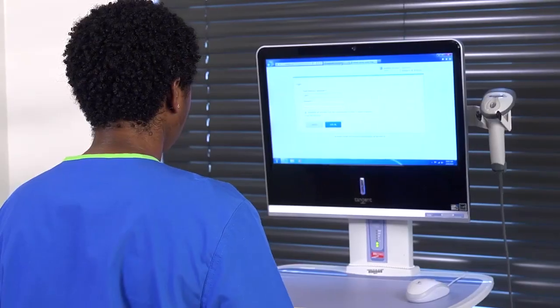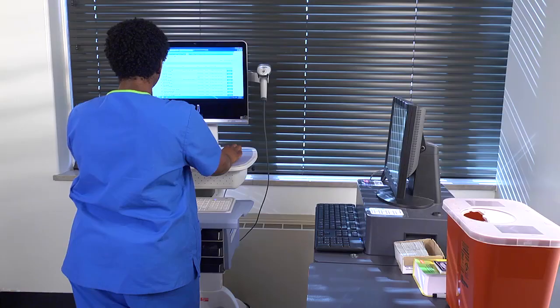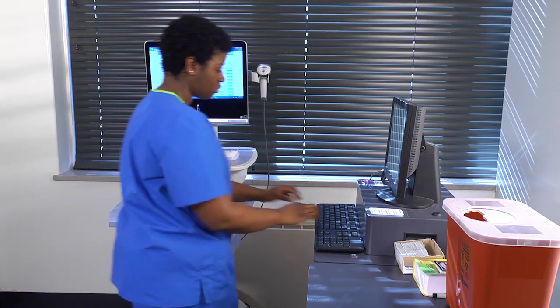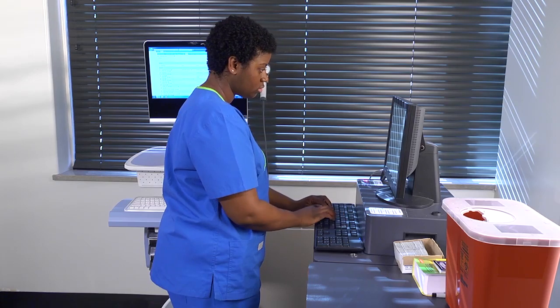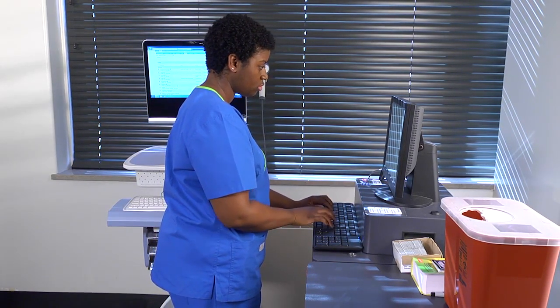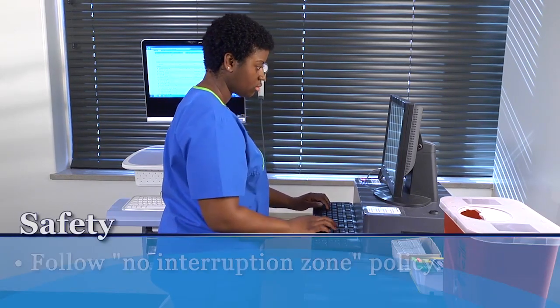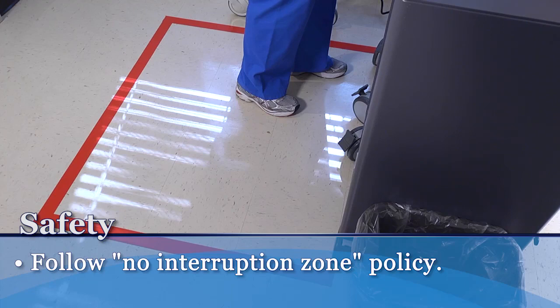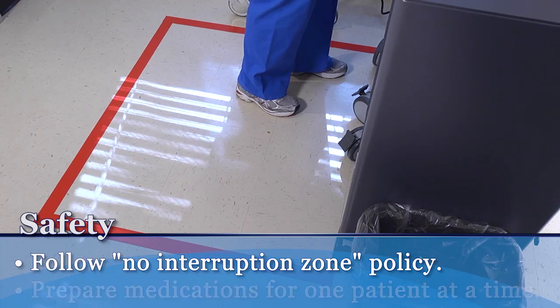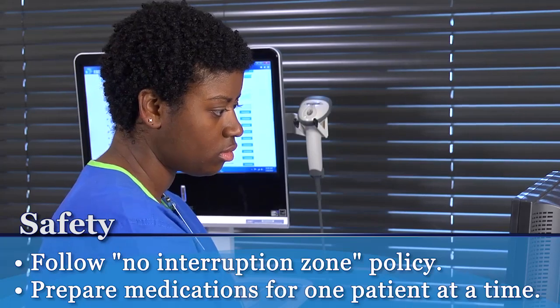To prepare an injection from a vial, first verify the healthcare provider's orders. If you're using an automated medication dispensing system, log on and access the patient's profile. When preparing medications, it is important to avoid becoming distracted. Follow your agency's no interruption zone policy and always prepare medications for only one patient at a time.